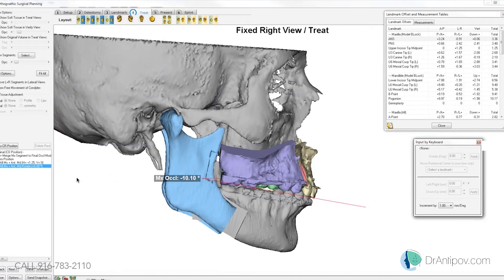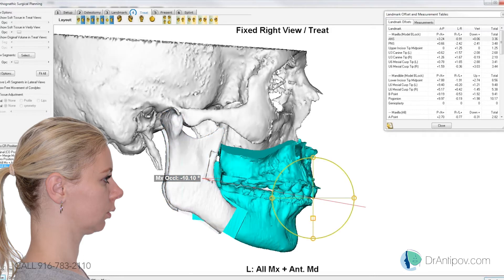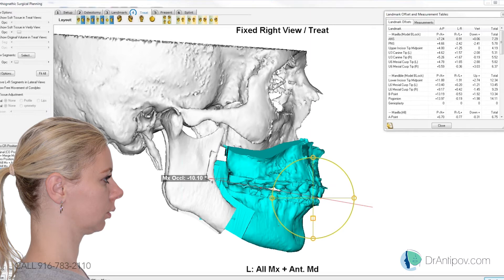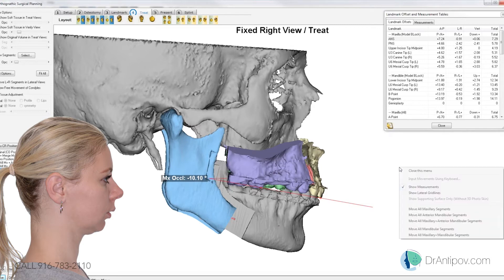We'll go ahead and come to that profile view now. What sort of advancement did you want to make here? We're thinking doing 4 millimeters at the incisal edge at the upper, and doing the occlusal plane correction of approximately 95 degrees to the true vertical — in your case 5 to 6 degrees. Let's see how it looks.